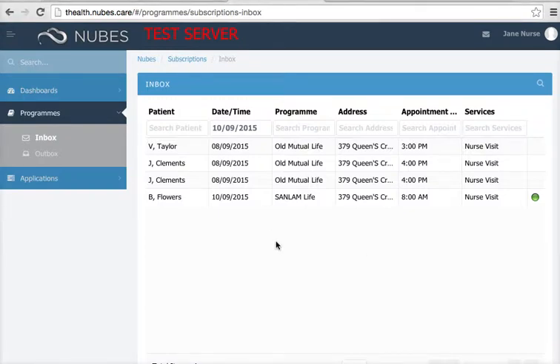All right, in this video we are going to go through the standard phlebotomy appointment. So this is just where you draw bloods and for the tubes, not the rapids. So we've set up a test case.